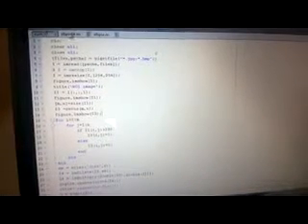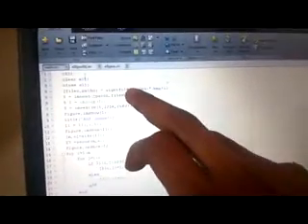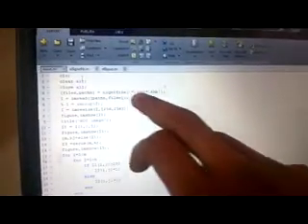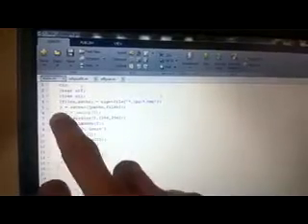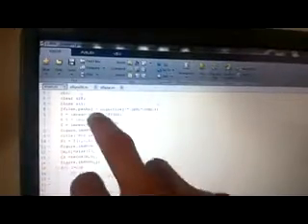In our project, we have three programs: one main program, the second is ellipse fitting, and the third is ellipse. First, we go to the main program. First, we have to select a file and path. It means it will get the file from the specific path. It will only get images with formats like JPG and BMP. I equals imread of path and file, and this stores the image in I. Then we resize the image to 256 by 256. Then it will show the image.